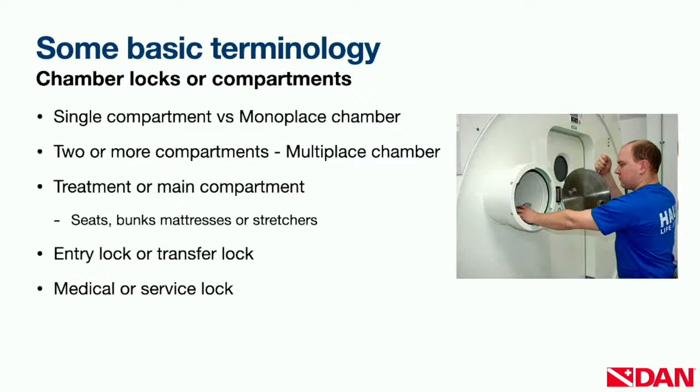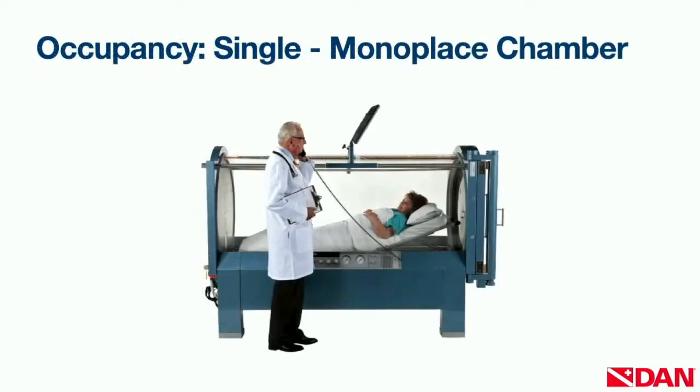And then the last of these terms is called the medical or the service lock, and this is essentially a small transfer lock where we can put medications, food, blankets, and various other things needed by the occupants on the inside, and it allows us to do that transfer under pressure. So getting something in without having to release the pressure in the chamber.